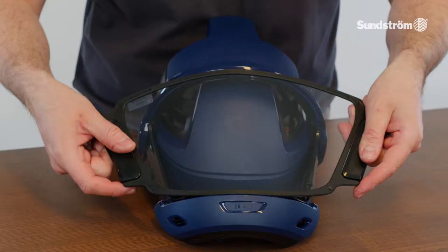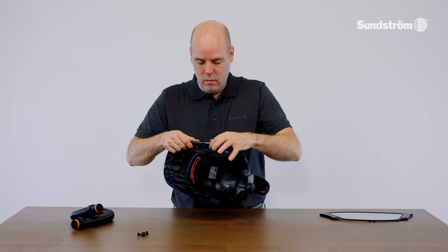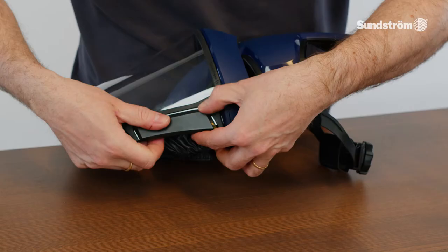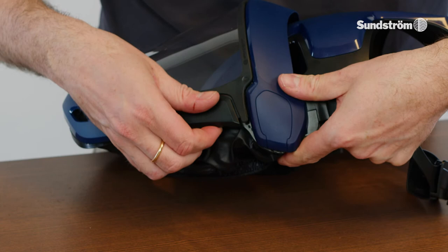Fit the new visor. Start in the center. Make sure that the visor is centered and seated in the groove on the face shield. Secure the visor on the right and left side. Check that the visor is properly locked.